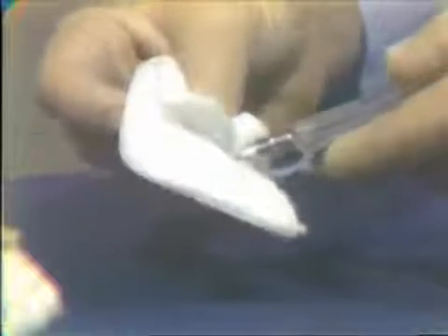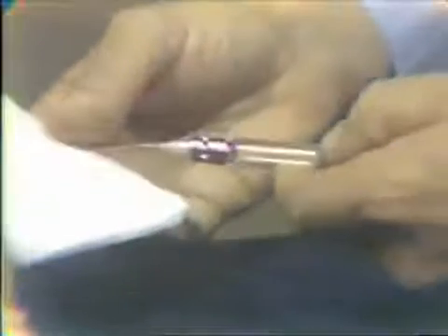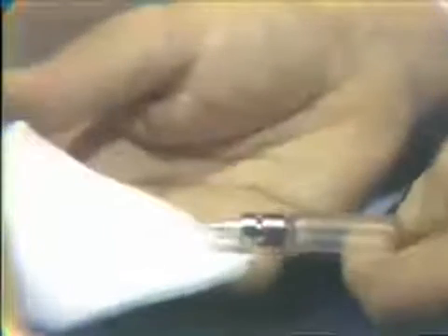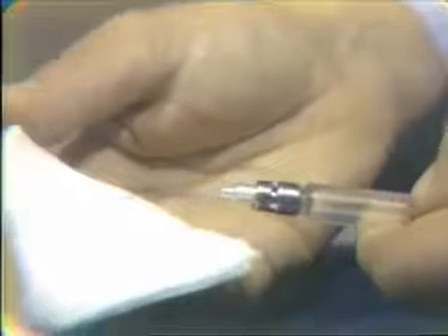These steel needles are a little passive so that you can get a curve in them. I don't know whether you can see that or not, but you can see that our needle is curved. And this allows us to stay closer to bone as we approach the posterior superior alveolar foramina.